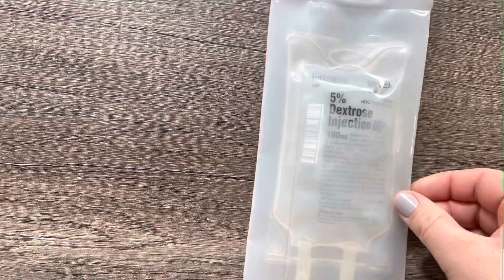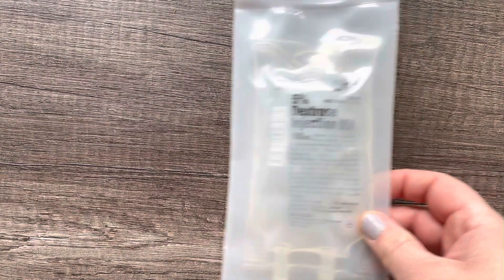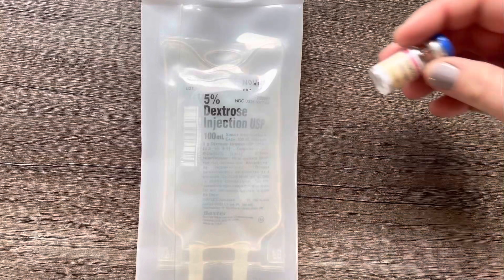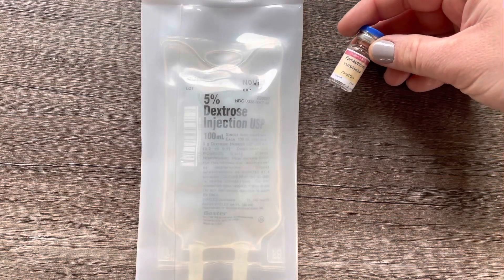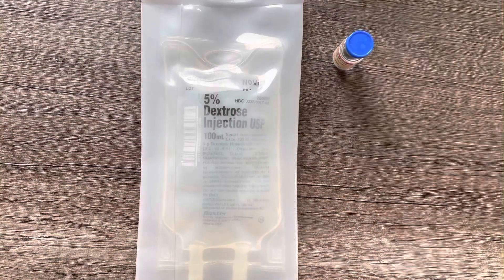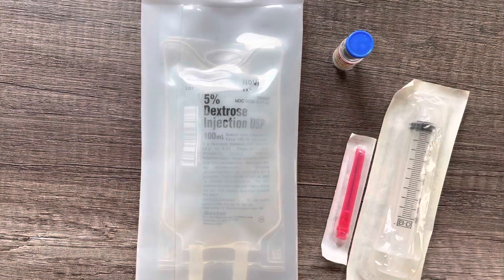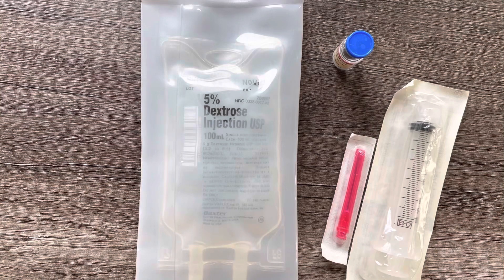Things you'll need: your 100 ml bag of either saline or D5, your epinephrine which is one-to-one-thousand or one milligram per one ml, and then a syringe to draw up the medication and mix it in the bag.